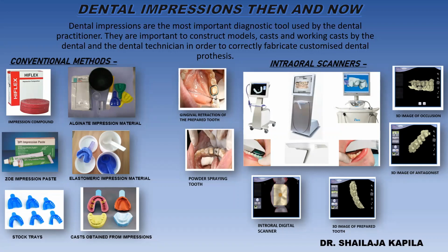The patient receives a standard preparation of the abutment tooth under clinical criteria. To expose the margin of preparation, 2 retraction cords of selected sizes are placed in the gingival sulcus. After waiting approximately 5 minutes, when the sulcus has expanded adequately, the area around the abutment tooth is rinsed and air-dried thoroughly for the scanning. If powder spraying is required in accordance with the manufacturer's instructions, a special sprayer is used to perform an opaque powder coating on the surface of the prepared tooth.